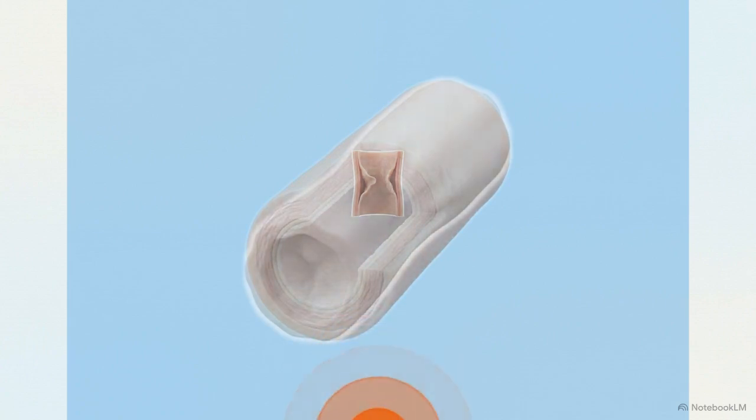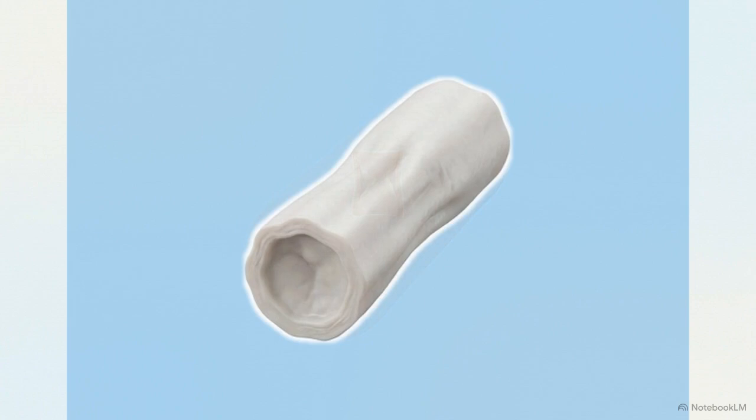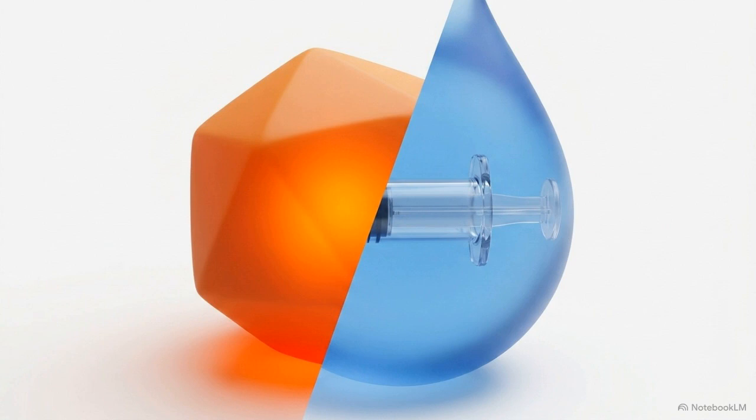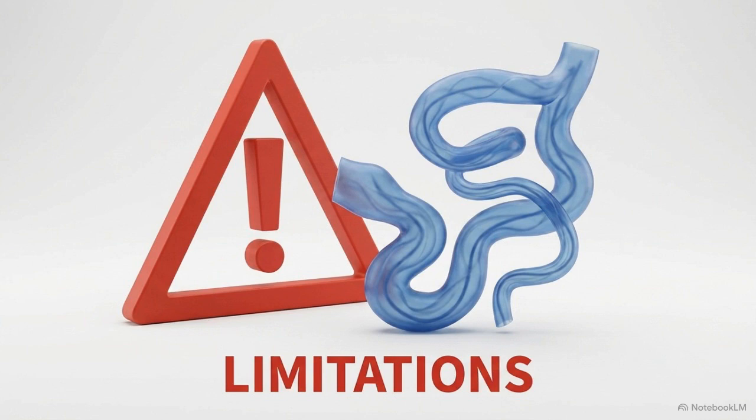With the barrier in place, the catheter tip emits targeted energy. As the physician steadily withdraws the fiber, the controlled thermal injury causes the vein walls to shrink inward and permanently fibrose, sealing the vessel shut. Thermal ablation consistently achieves high closure rates for standard veins. However, the exact mechanisms that make it work, intense centralized heat and a dense fluid-filled protective barrier, create physical limitations when we encounter complex anatomies or patients who cannot tolerate the fluid injection.